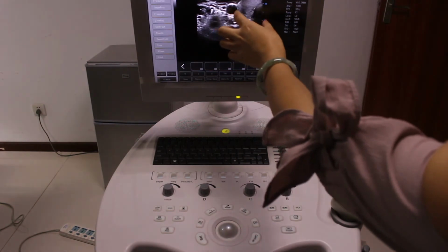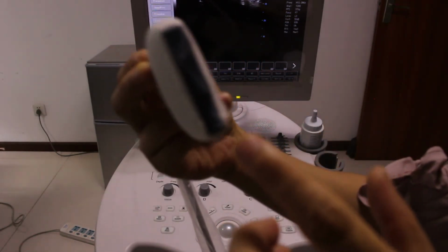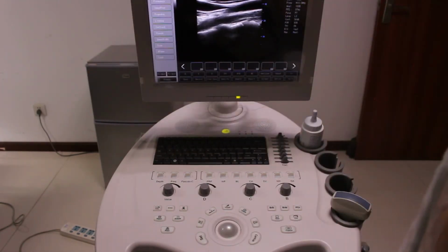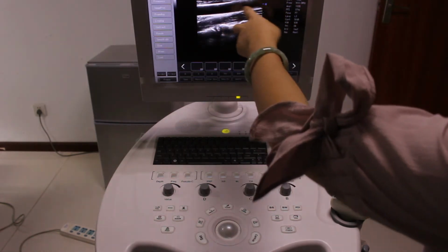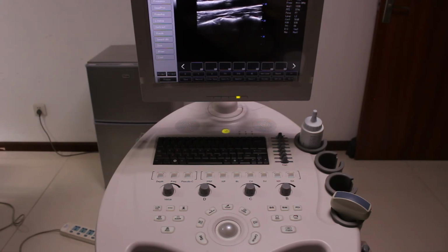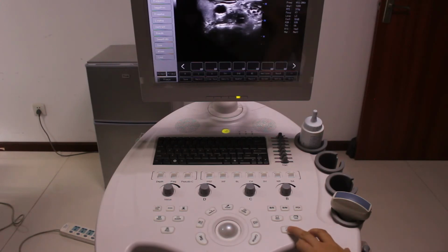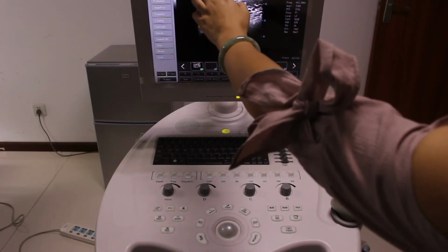This is a horizontal view. And if you want to get a vertical one, put it in the carotid position in the vertical direction, then you can get this one. This is the vertical image. So this is the B mode. If you think this image is the one that you want, then you can press freeze here and press save. Now you can see the image is saved onto the patient.